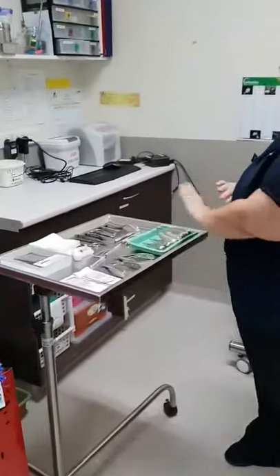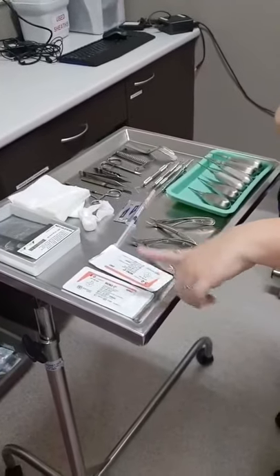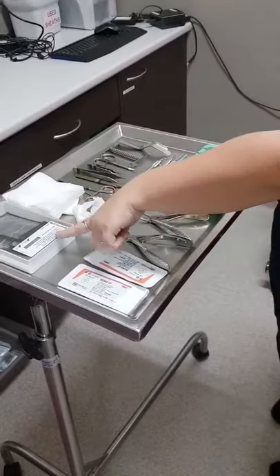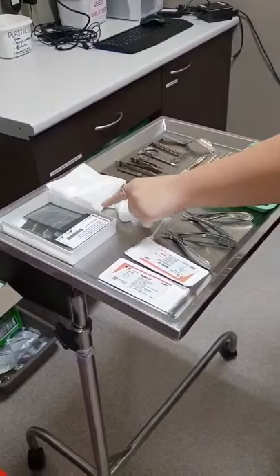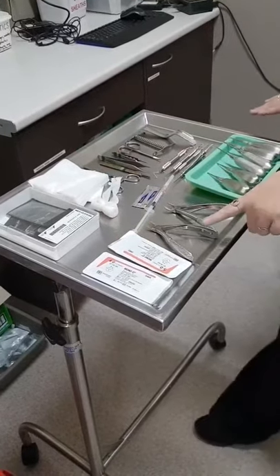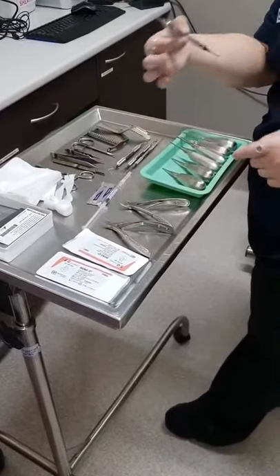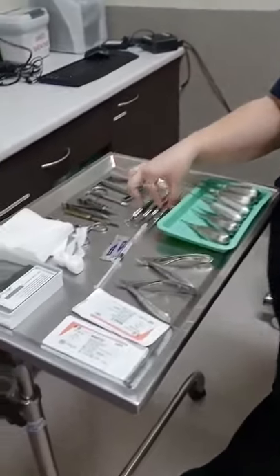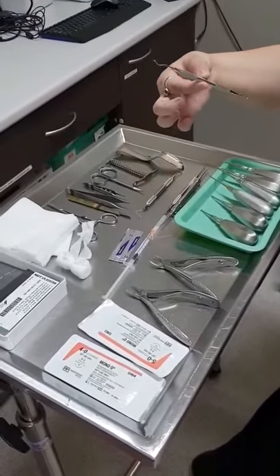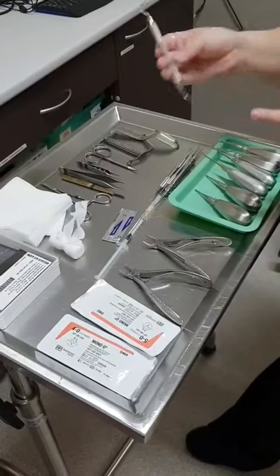First of all, we have our equipment set up already. We have our suture material, which is either 4-0 or 5-0. We have our x-ray plates, some swabs, a mouth gag for the back of the throat, our extraction forceps, our elevators, our deciduous tooth elevator, our curette, and we also have our periodontal probe and the explorer probe.